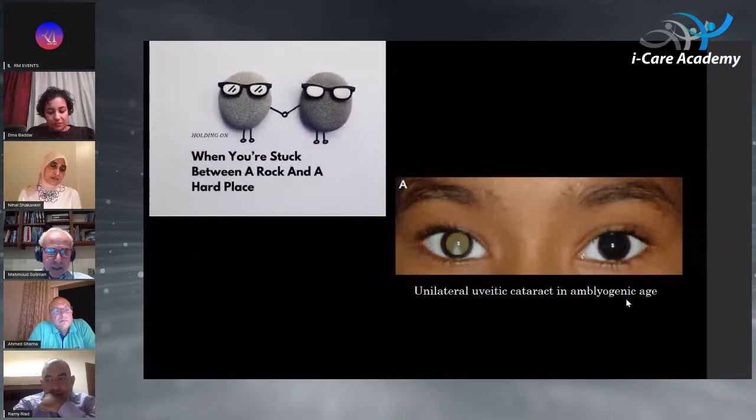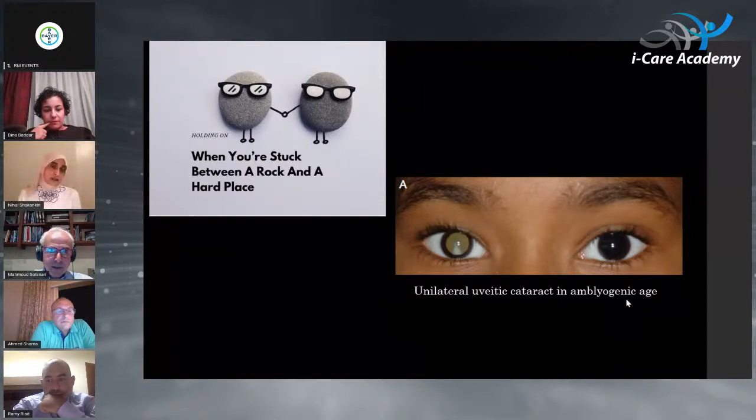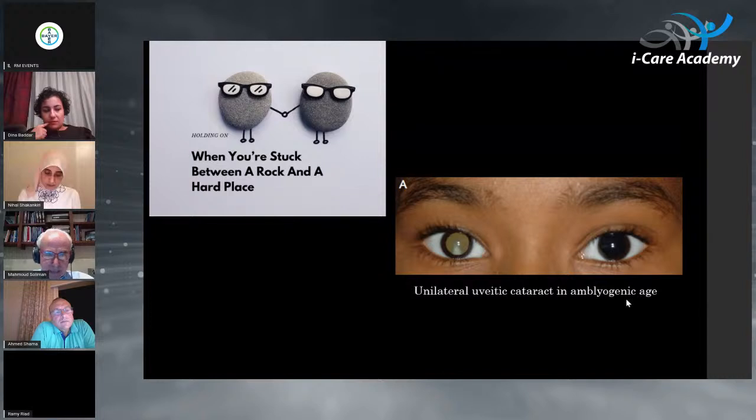That is when the patient has a pupillary block, and in some of those patients it develops into a severe pupillary block with severe glaucoma, and you have to interfere because the eye will never calm down because of the vicious circle of glaucoma. In these cases, you have to change the technique and revert to a lensectomy technique. Usually in these particular cases I'm talking about, the anterior segment is totally disrupted and you're not able to do a proper phaco.